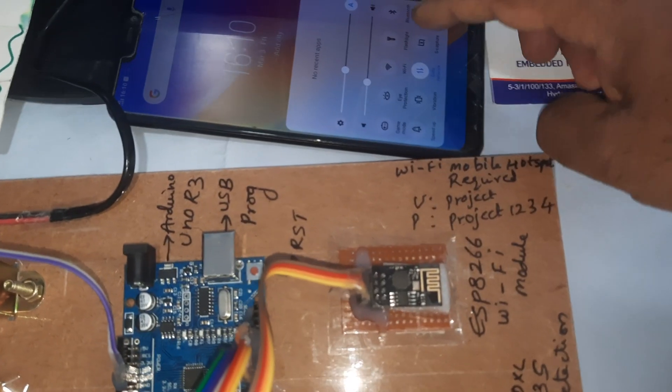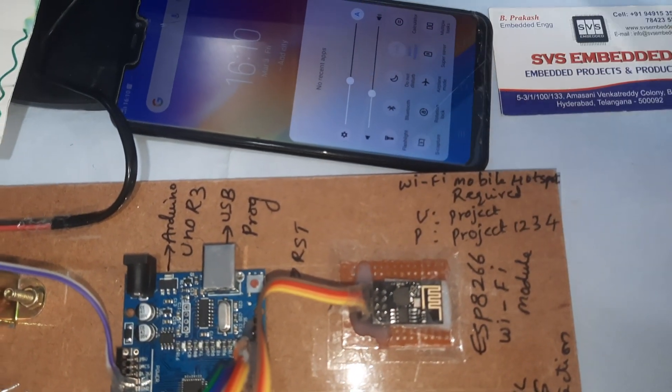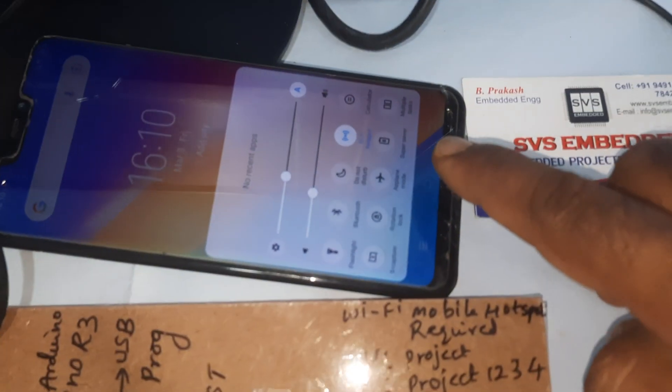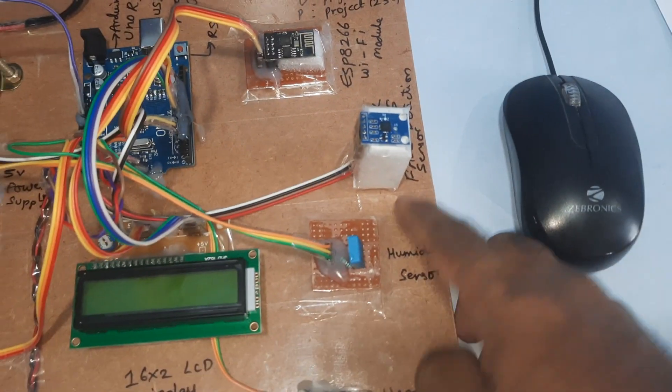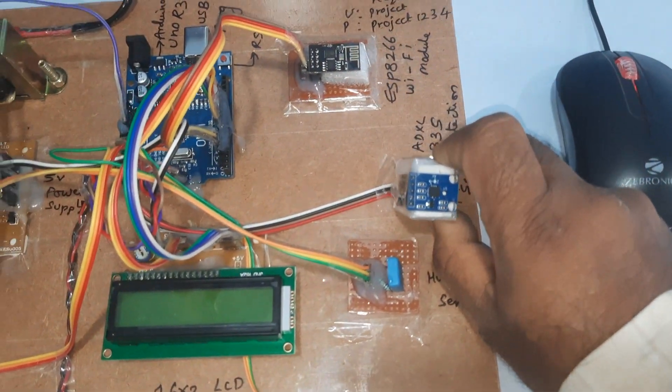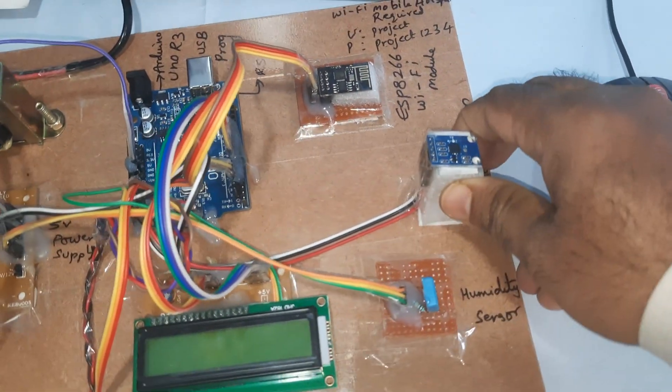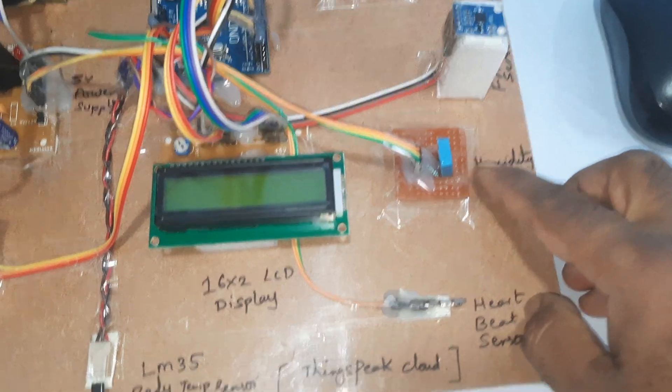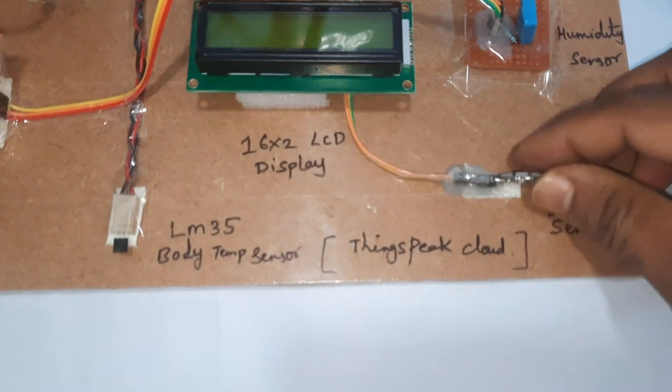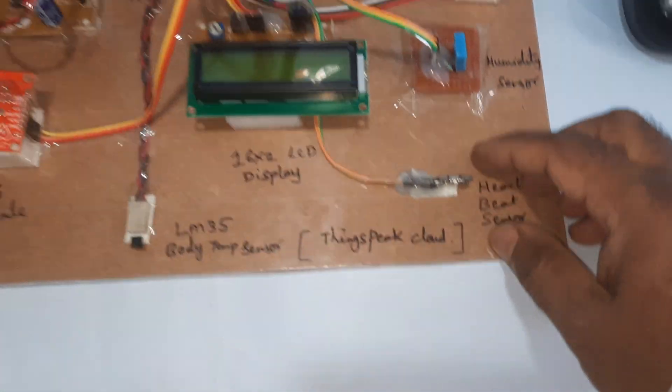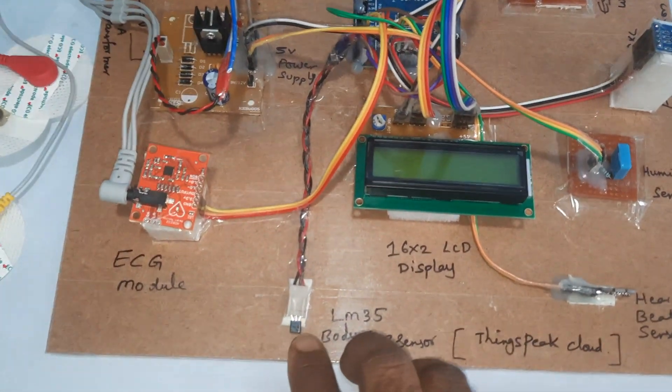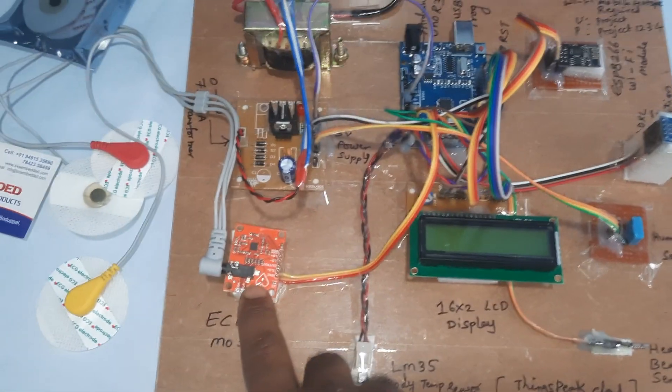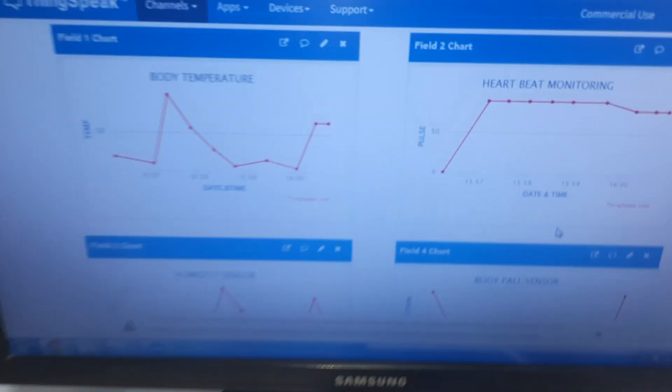ADXL335 fall detection sensor detects either left fall or right fall. We have humidity sensor, heartbeat clip with our heartbeat module, LM35 temperature sensor, and ECG module.